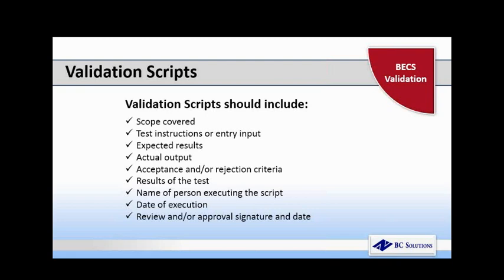Another element of the validation are the validation scripts. They may be called validation testing plans, they may be called test cases, but whatever it's called, the validation scripts will tell you what information to enter and contain the details of the outcomes of the testing. There's no standard script format required. There are no regulations that say you have to use a Word document or an Excel spreadsheet. It's whatever's going to work best for you and your facility.